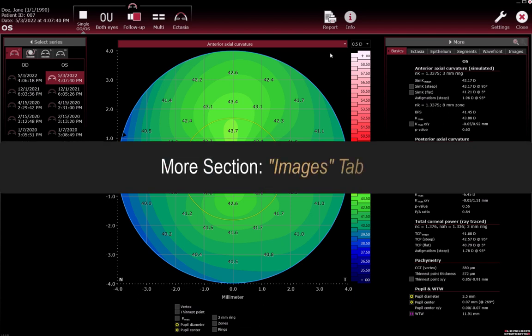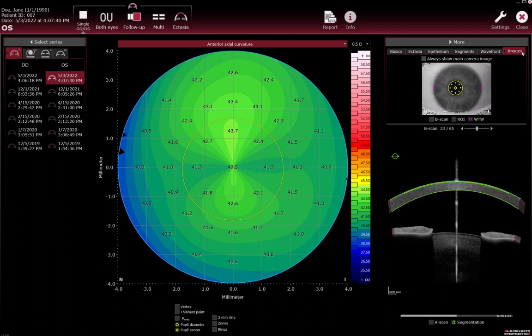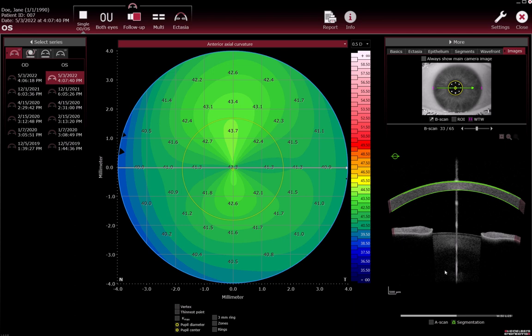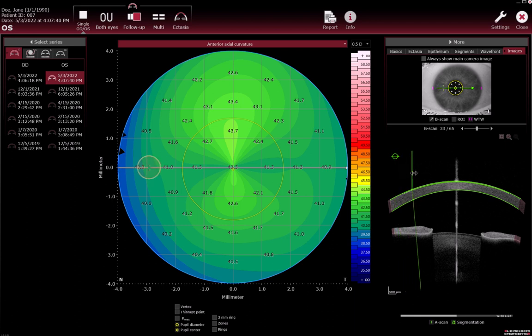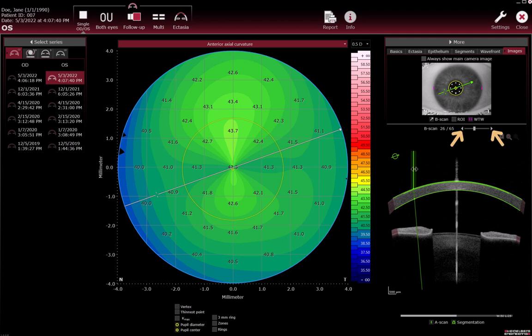More section Images tab. Various parameters can be superimposed as overlays on the images by selecting the checkbox next to the overlay. Drag and drop to move the A-scan. Watch the aligned cursor in the B-scan overlay superimposed on the colour map. Scroll through the different B-scans, or click the backward or forward symbol on the B-scan slider.